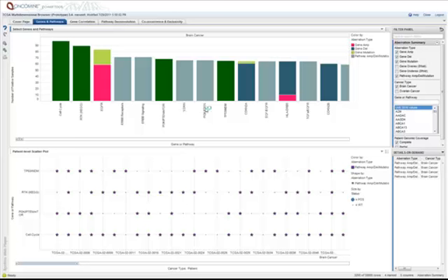In this view on the bottom, having selected these 4 pathways, we're showing a case-by-case view. Each column is a TCGA glioblastoma case, and we're starring cases that have an alteration in the pathway. I think what you can see here is that, for the most part, glioblastomas have alterations in many, in some cases all, of these affected pathways. That's one interesting observation, and I think it poses a challenge when thinking about targeting glioblastoma. Glioblastomas often have multiple aberrations across multiple cancer pathways.